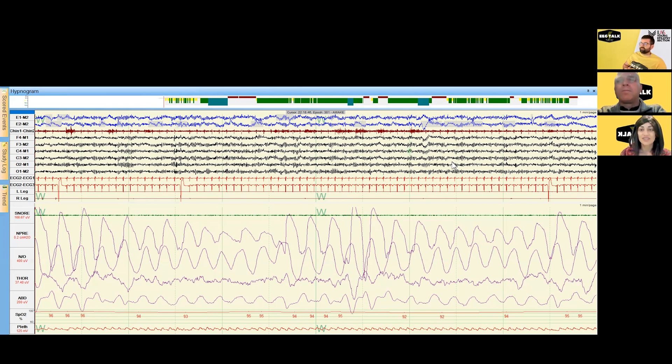When we do EEG we typically look at 10 seconds per page, but for sleep study staging and scoring the recommended page speed is 30 seconds per page. I have this set at one minute per page because it's a little easier to look at respiratory events at a slightly higher sweep speed. For neurologists, it's a very different view seeing everything crunched together, but that's the reason we do it.